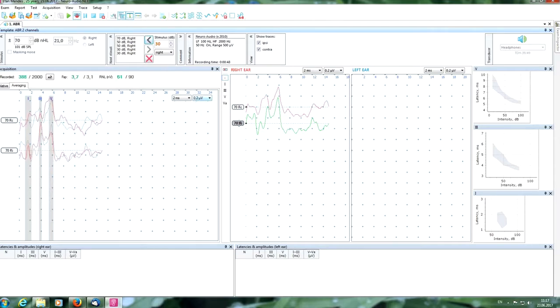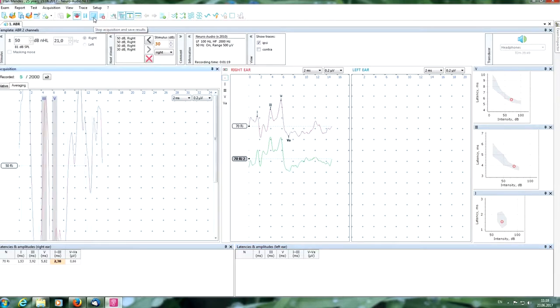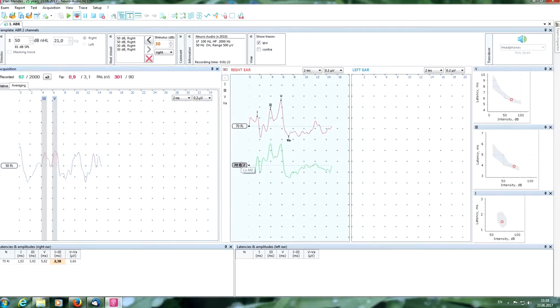and they will be run automatically. Here we can see curves for the contralateral and ipsilateral side. If you want, you can switch off the contra curve. Now you can put the necessary markers, the first wave, the third wave, and the fifth wave, on the curve. Now we get the second response. It is good, high reproducibility, as you can see. We can manage the second curve and put the markers.